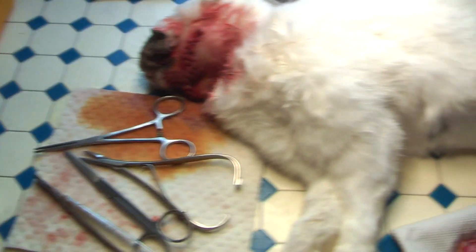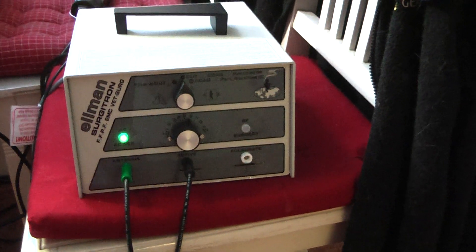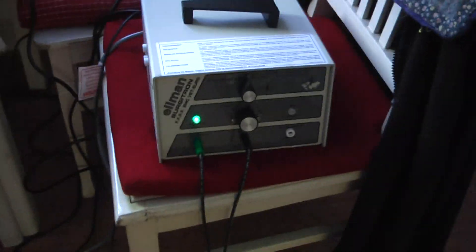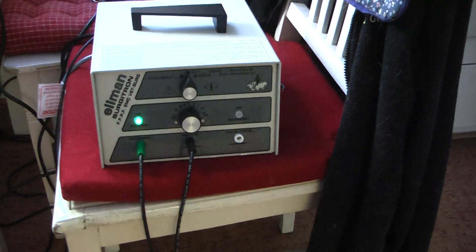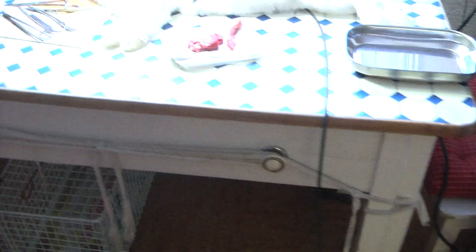Instead of using a knife for surgery, I use this one. You cut by radio waves, so it's called radiosurgery. You can work a lot faster, but you need electricity. You cannot do this outside, out there in the bush.